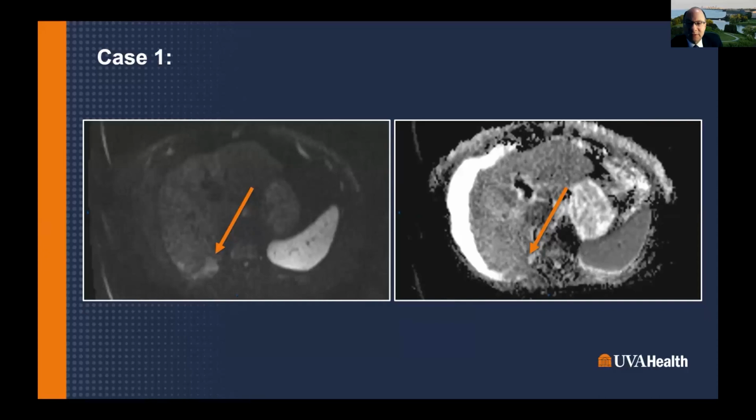So, I guess without seeing the case, it's hard to know what you're describing. I think it's reassuring that it's getting smaller. To me, at least, it suggests that it's potentially responding. And if they felt like it was targeted well, and as I illustrated, that there are radiation effects along the whole course of it, then I feel more comfortable. I haven't seen too many like you're describing, where the tumor gets more, quote unquote, restricted, I guess. But I guess if it is restricted, then me either.